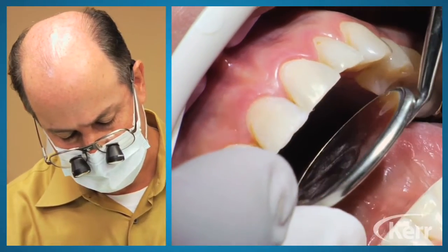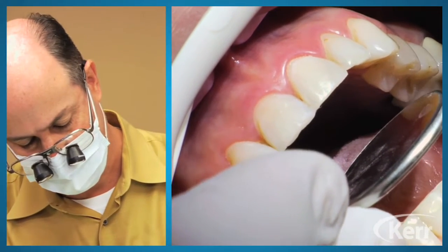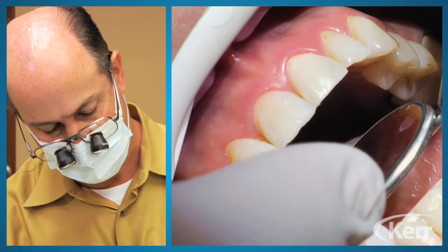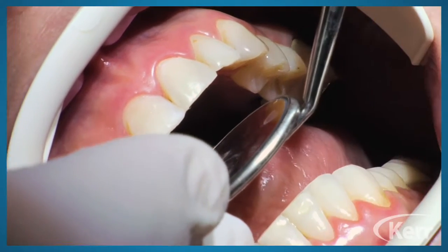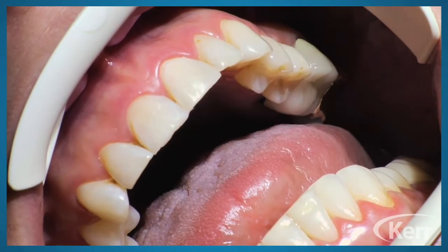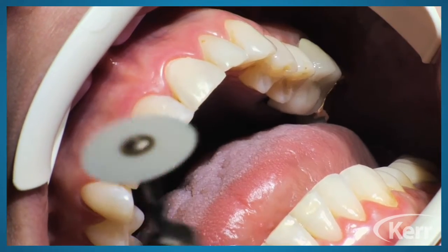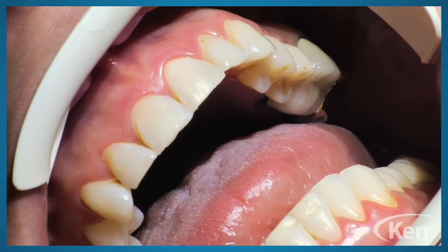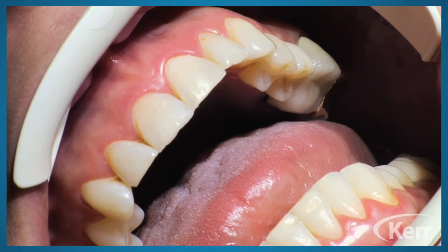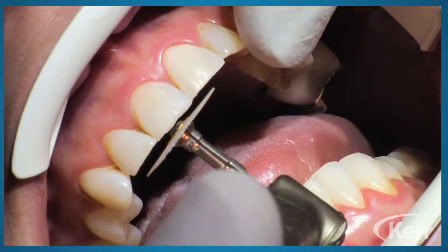Now, if you notice, this tooth was tucked a little bit behind the tooth number 8 before we started, and I've brought it out a little bit, so I'll probably compromise somewhere in the middle, just a little bit on this. So I'm going to use a disc system at this point, and you use whatever disc system you're comfortable with.